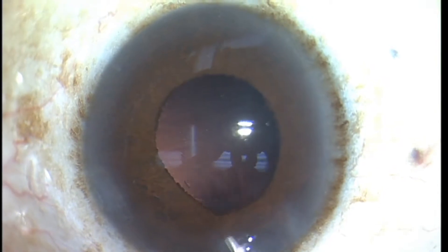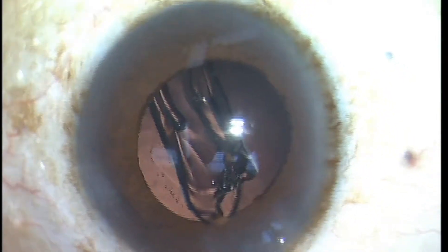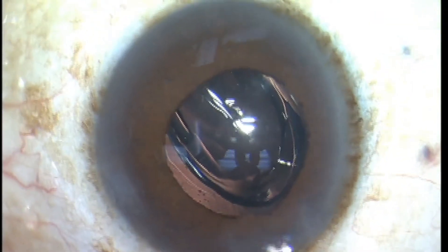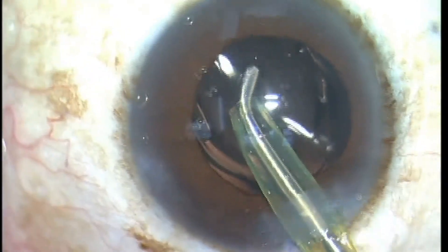Right there you saw me very cautiously removing the IA tip out because I didn't want that iris to prolapse through the main incision again. I used OVD to temporarily dilate the pupil so I could see to put the implant in. But look how much smaller the pupil is now, and as soon as I start IA and remove the OVD, the pupil is going to come down even more.